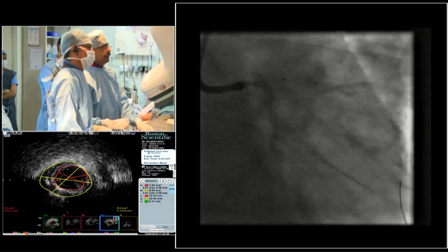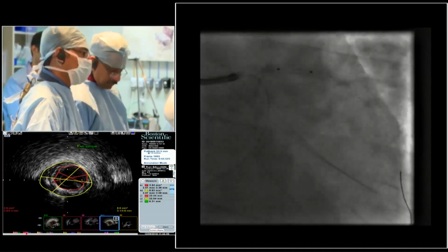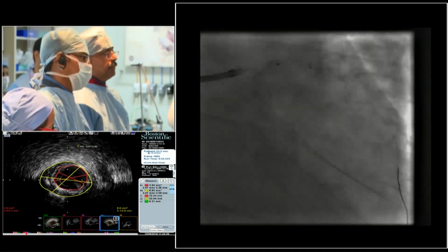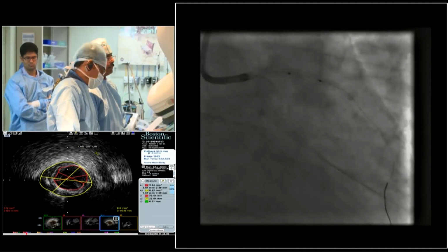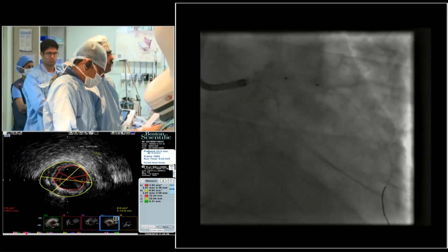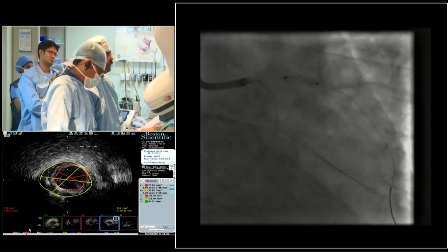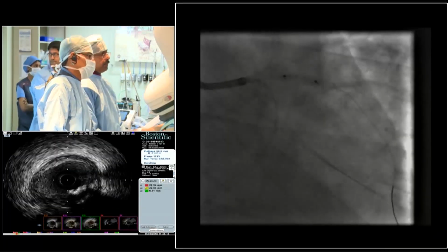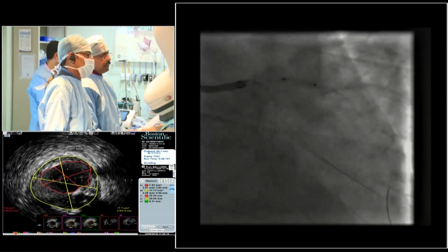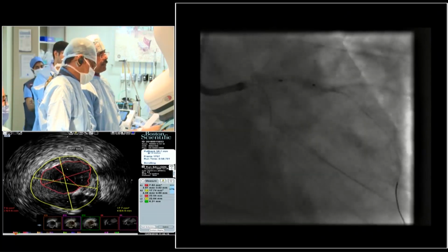Any other comments? Retrospectively, do you feel that in case the IVUS catheter had passed without balloon dilatation, rota would have been a better option? You see, the only issue is that the whole lumen is too big for the rota to shave. We'll need a big rota burr to shave that off. It's almost a big lumen. That is the problem with the rota.